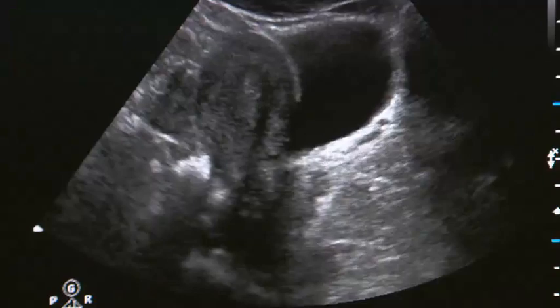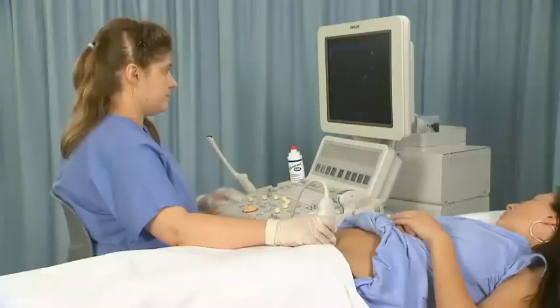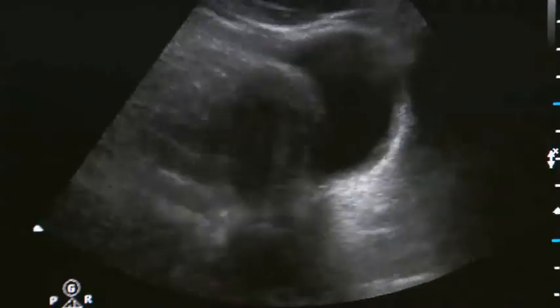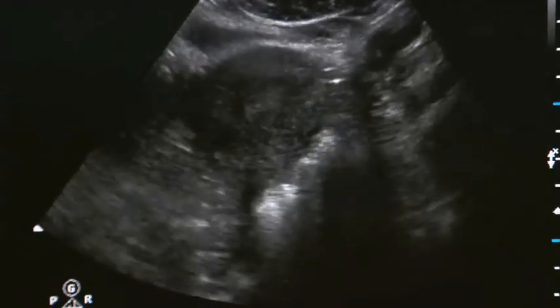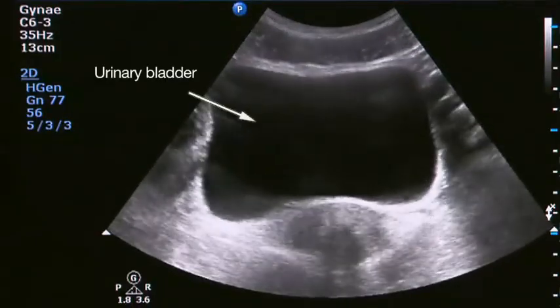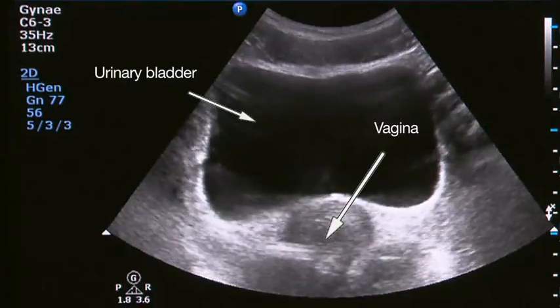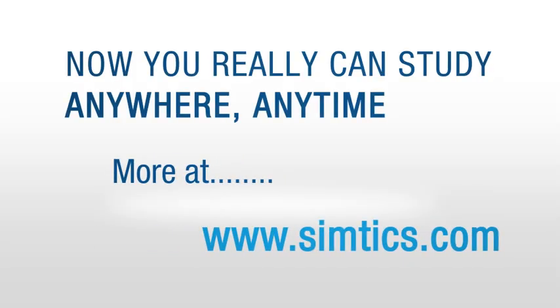Return the transducer to the midline. Commence the transverse scan by rotating the transducer counterclockwise 90 degrees. Manipulate the transducer to keep the vagina in view through the distended bladder, then sweep superiorly from this position to visualize the vagina, cervix, and then the uterus.